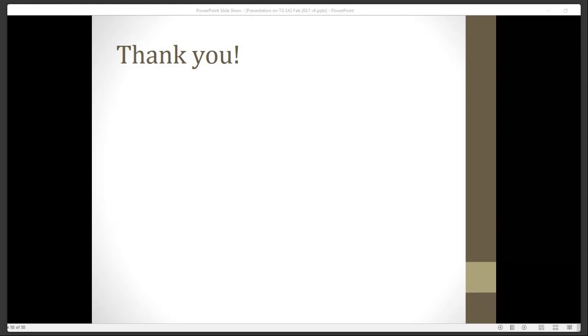All right, here's another one. Is it expected that if your monthly flatness symmetry is off by 1.5% from baseline, that you should bring someone in to rebalance, or should you keep an eye on it for a couple of months? That's a good question as well. We talked in the beginning about the action tolerances and these 3 levels: just inspection and monitoring it, scheduled maintenance, and stop, where you stop treatment until you fix the problem.